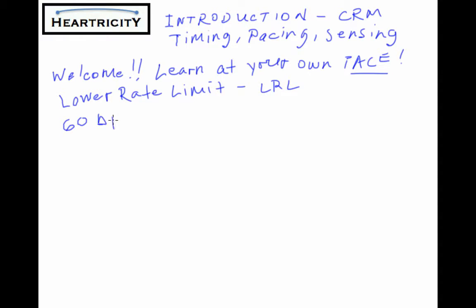Now, for illustration purposes, it's helpful to express this 60 beats per minute in beats per second. There are 60 seconds in a minute, which means for a pacer with a lower rate of 60 beats per minute, that's equal to 1 beat per second. So that's what we're going to use for this example.